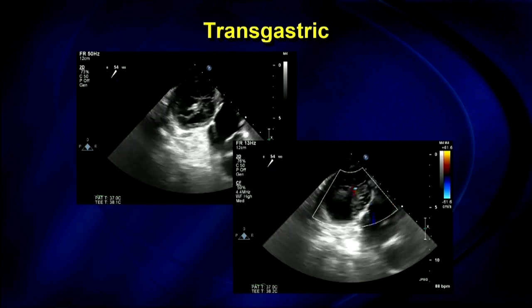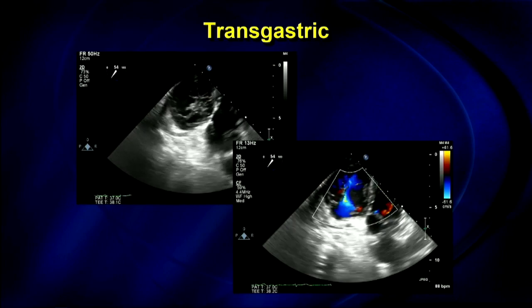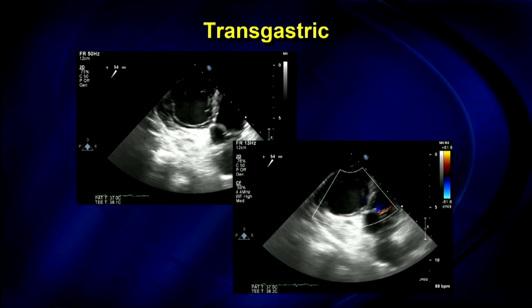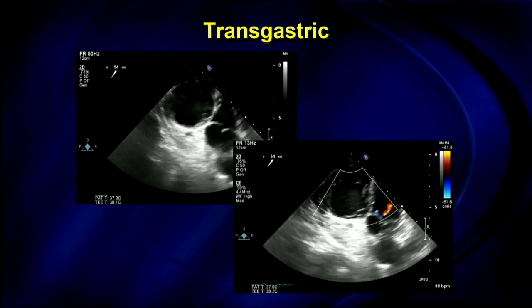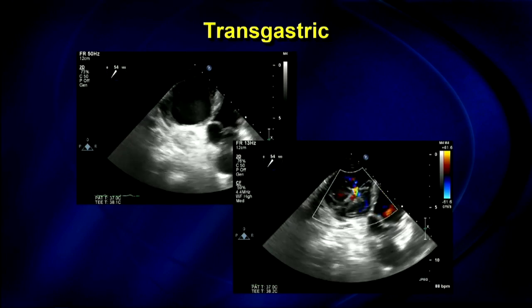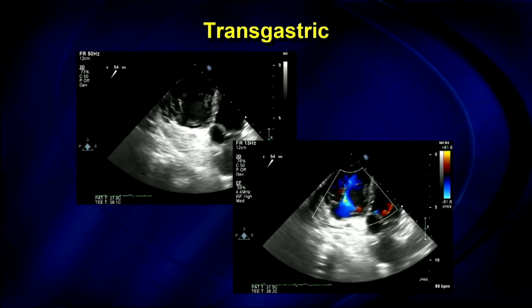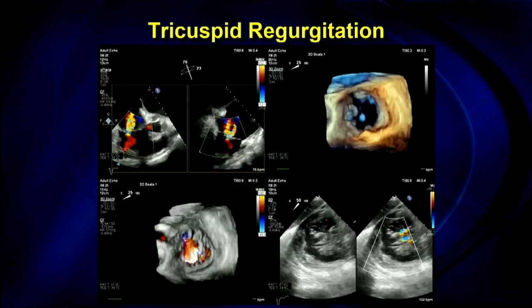So it tends to be a more shallow transgastric view. You've got to play with how much flexion you have on the probe, and then you have to play with the angle to get all three leaflets in view. So it's kind of using the force a little bit, but it takes some practice. But when you can get it, this really is key for tricuspid valve clipping.